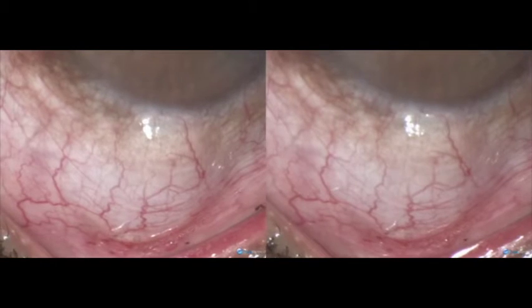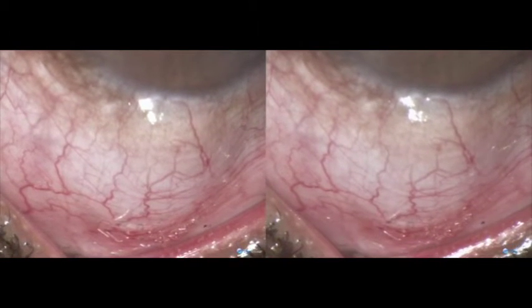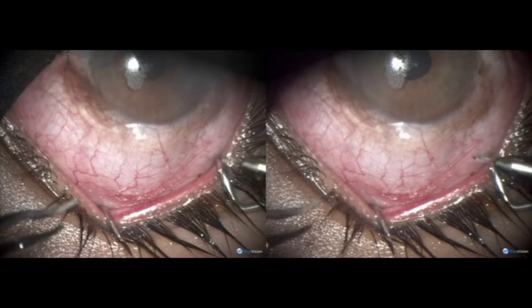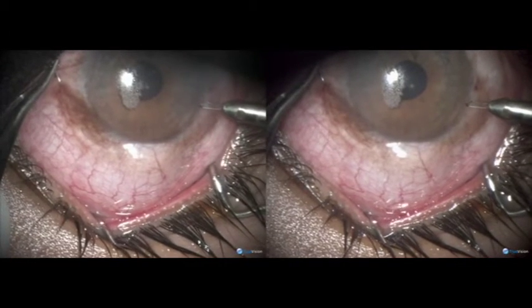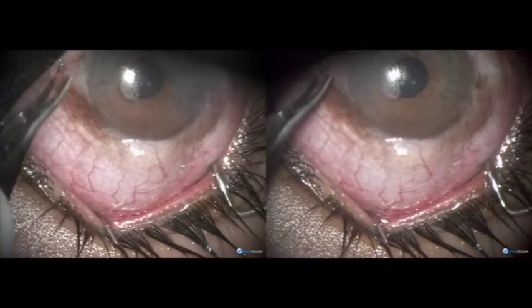The conjunctiva flap is big and far away from the track in the anterior chamber. After the tracks are made, we have to contract the pupil and inflate the anterior chamber.